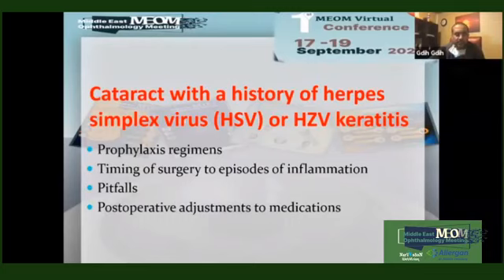But if I'm doing the surgery for one of my uveitic glaucoma patients who had a scar, for the safety of the procedure, I would use VisionBlue. I will watch them carefully. I try to drop the NSAID drops post surgery, and also watch because the majority of my patients are glaucoma patients too.